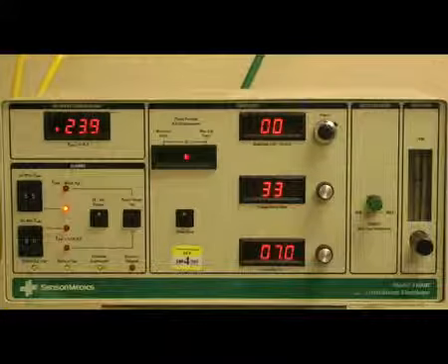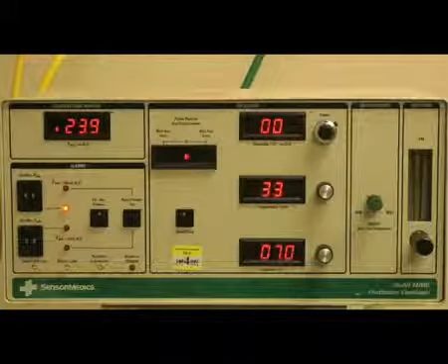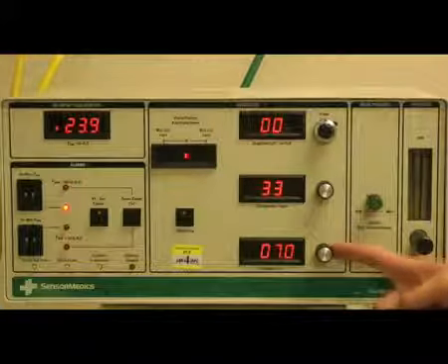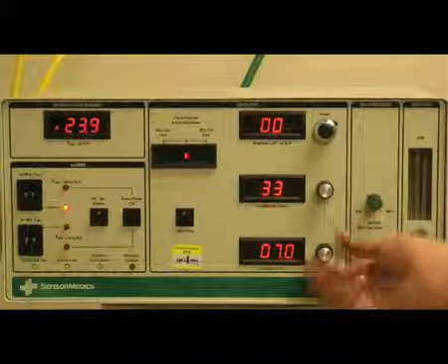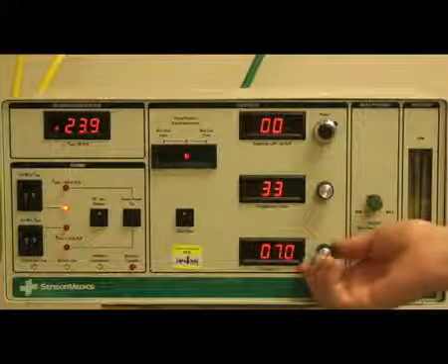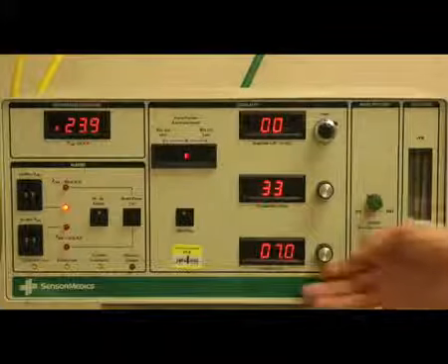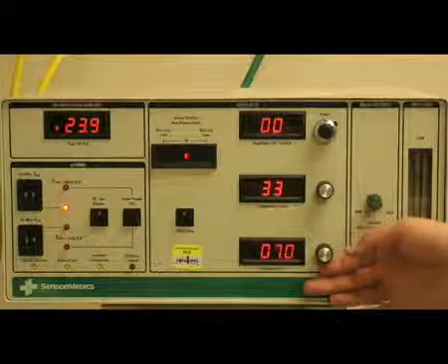It is important to remember that while the oscillator is more for oxygenation, there is also a ventilation component that must be adjusted. The main control for adjusting ventilation on the oscillator is your frequency. This will control both your rate and your tidal volume. Again, remembering that the higher the rate or the frequency equals a lower tidal volume. This is a result of the change in piston speed and distance within the housing. Higher frequencies mean that the piston drives a shorter distance and vice versa.